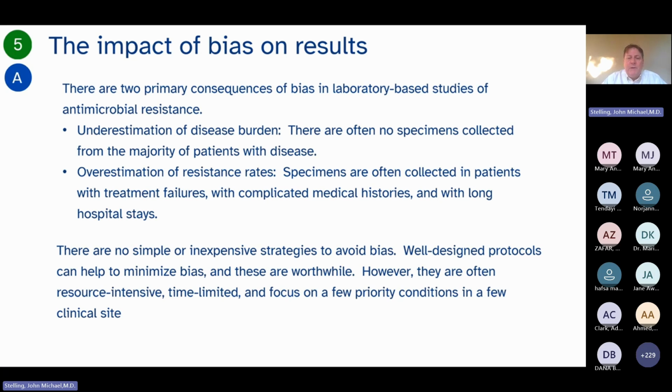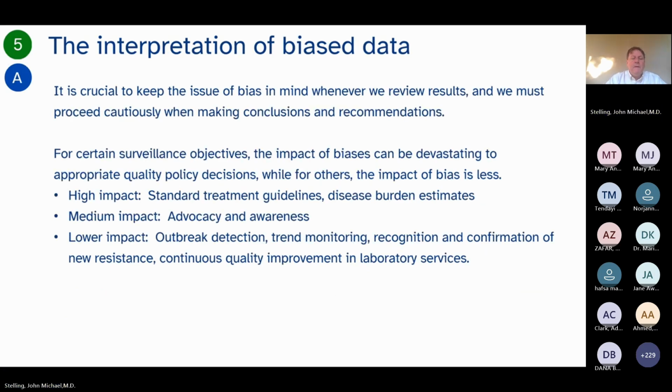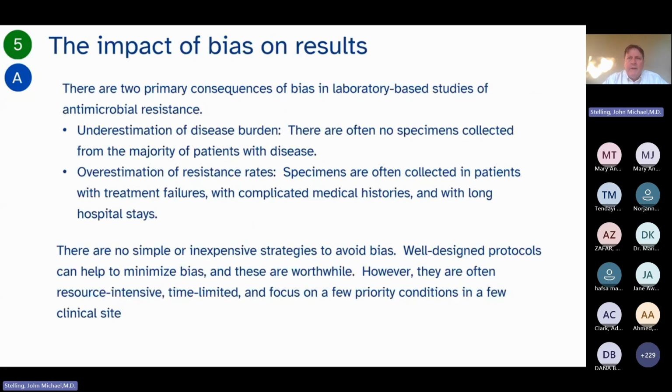It'd be incorrect to say we cannot use the data. You can use the data, but you need to be very careful when you do the interpretation. It gets back to this issue about precision and accuracy. If you have 5,000 E. coli, wonderful, your results will be very precise, but that does not make them accurate. They might not be very representative, and you need to keep that in mind. So part of the issue is how many isolates you test, but more important, are they somewhat representative?